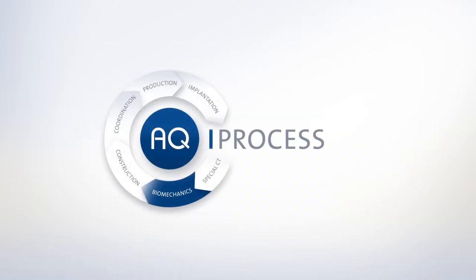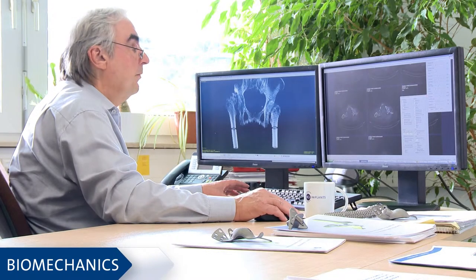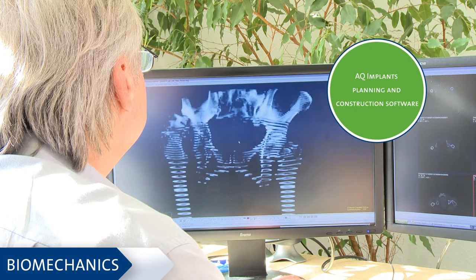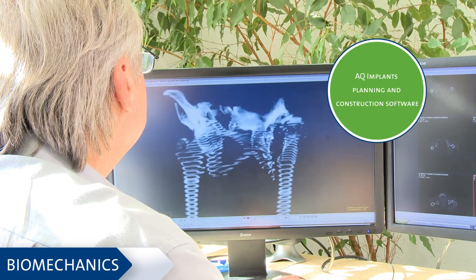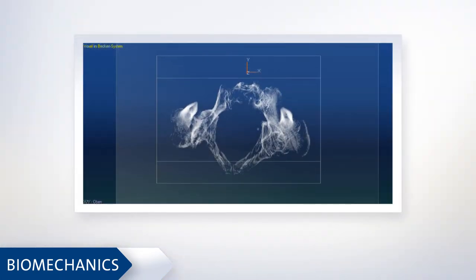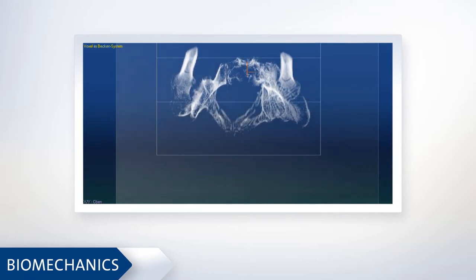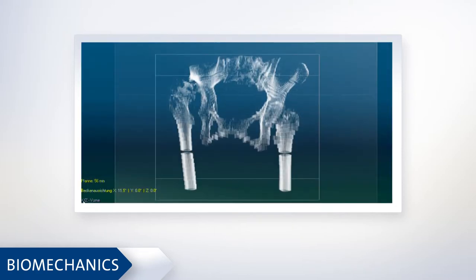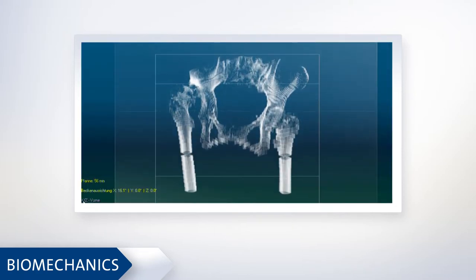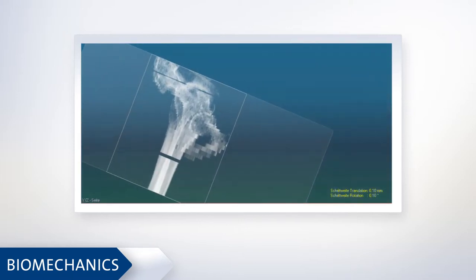Preoperative planning is performed on the basis of the acquired CT data. Biomechanical 3D planning is carried out using a planning and construction software developed by AQI Implants. At first, the orthograde alignment of the spine and pelvis is performed. Simultaneously, rotation around the longitudinal axis, around the sagittal axis, and around the transverse axis are adjusted.